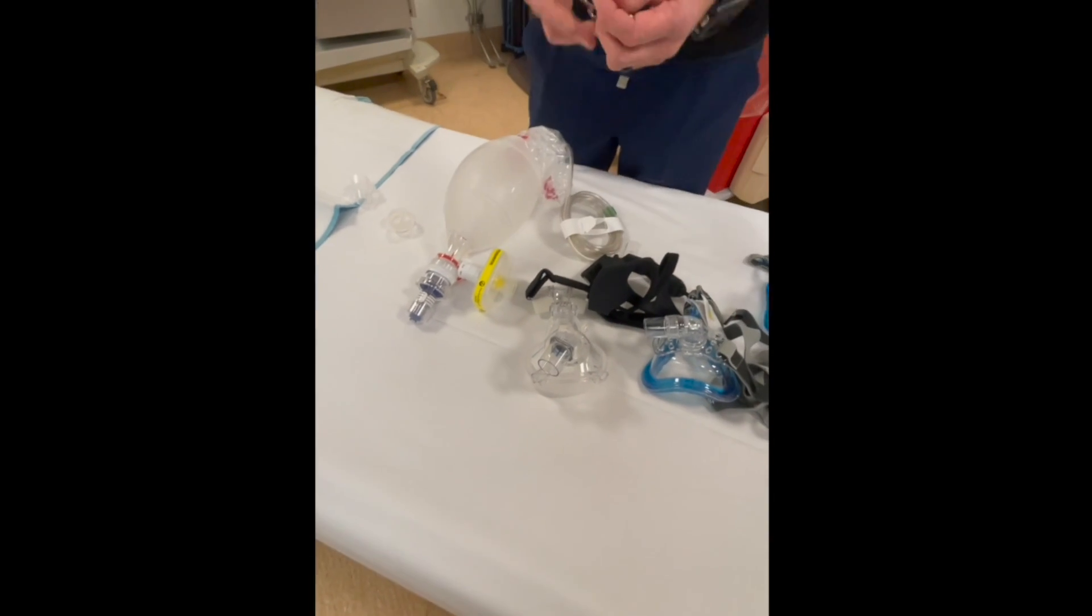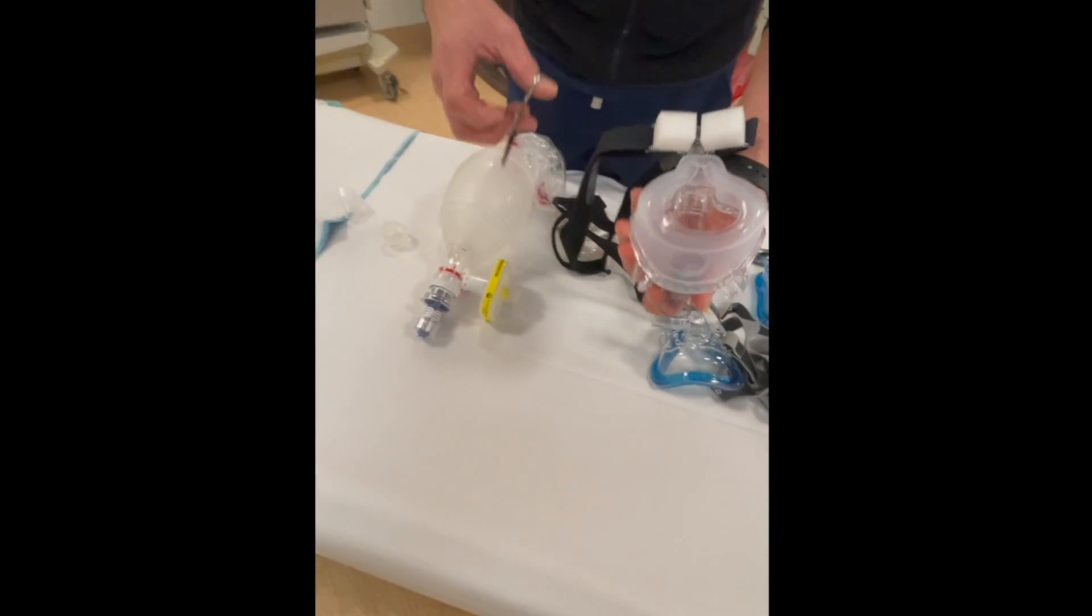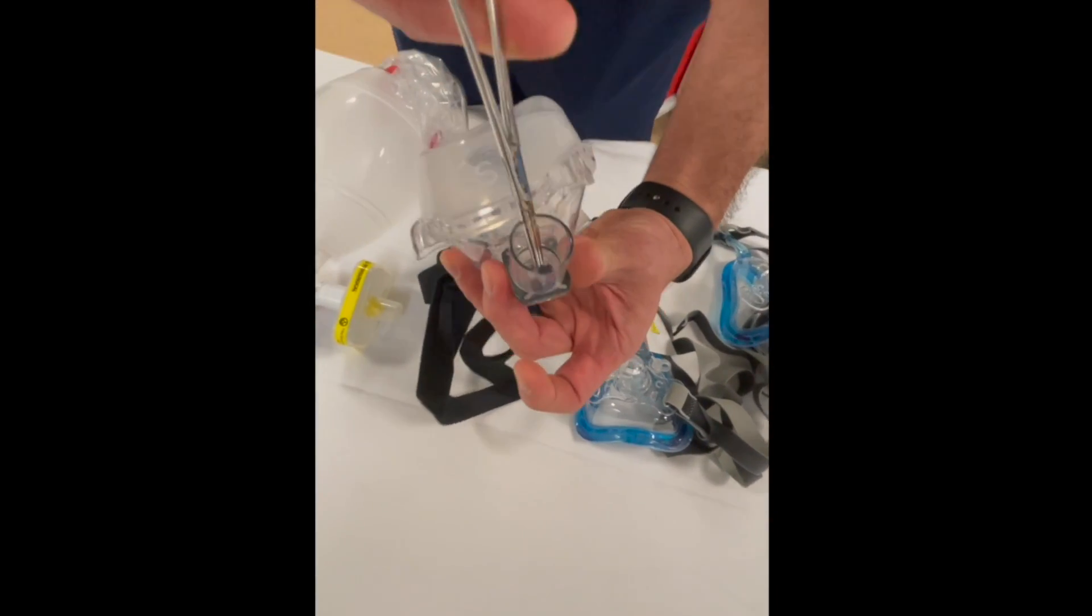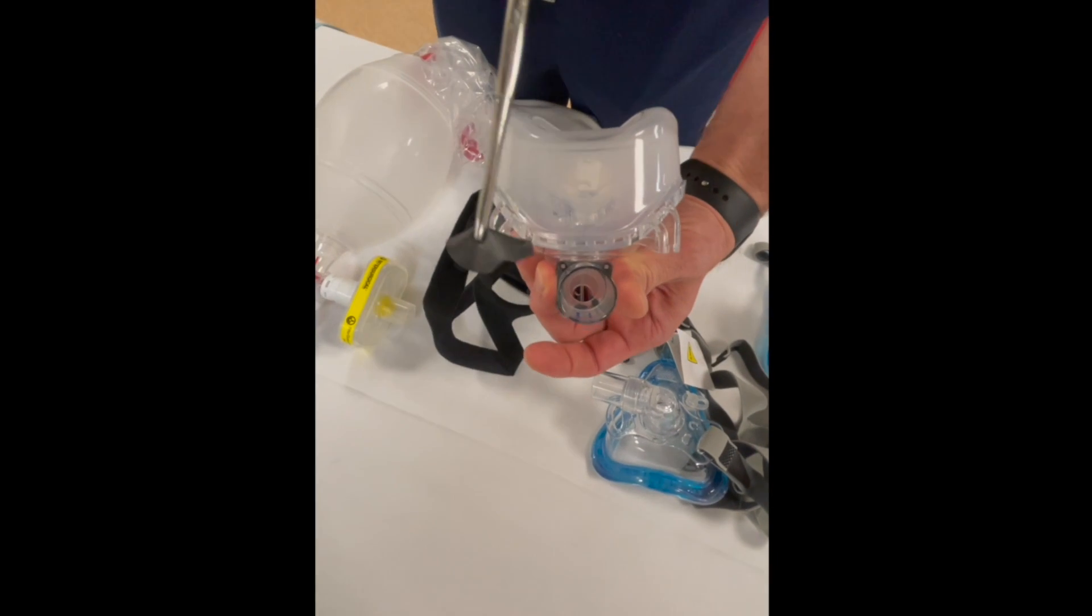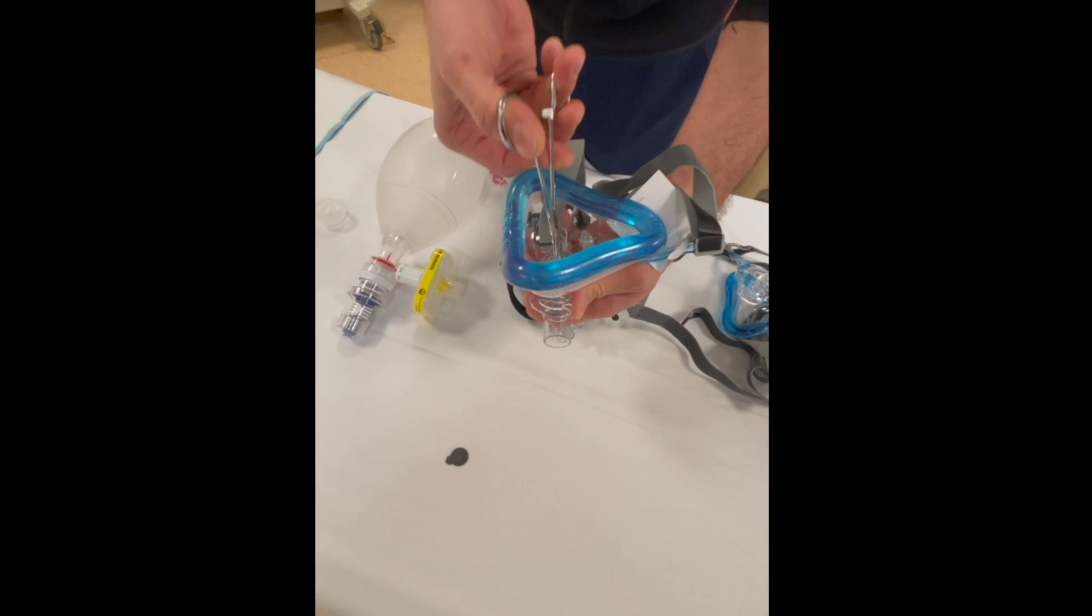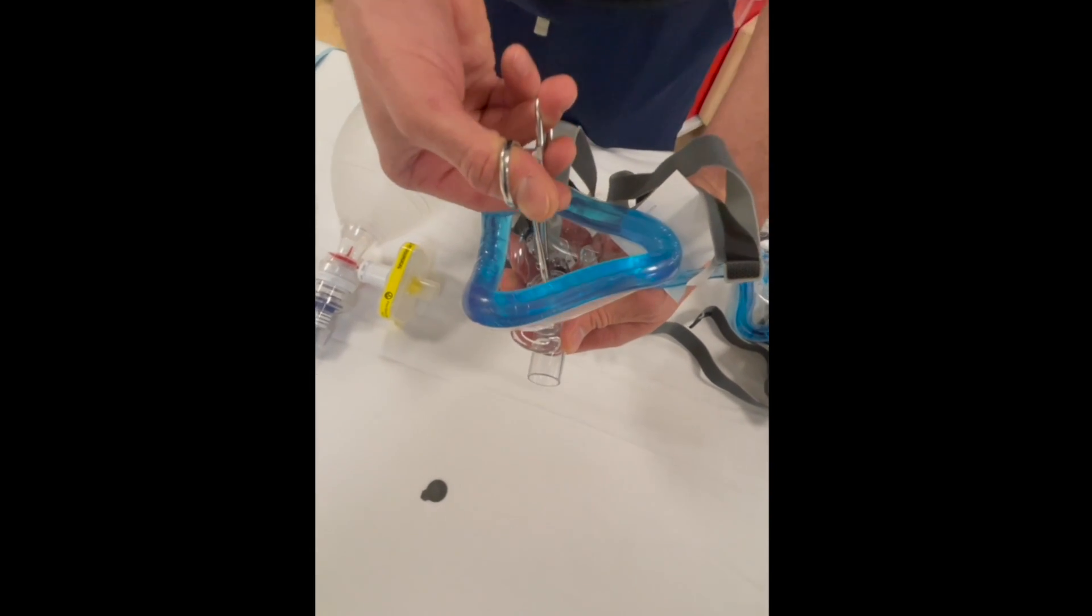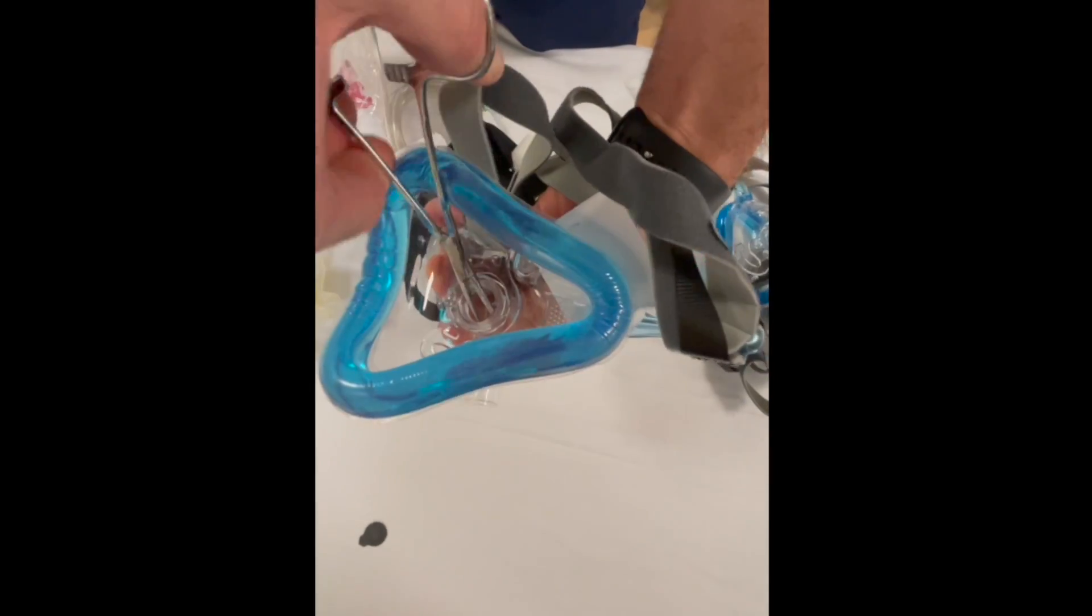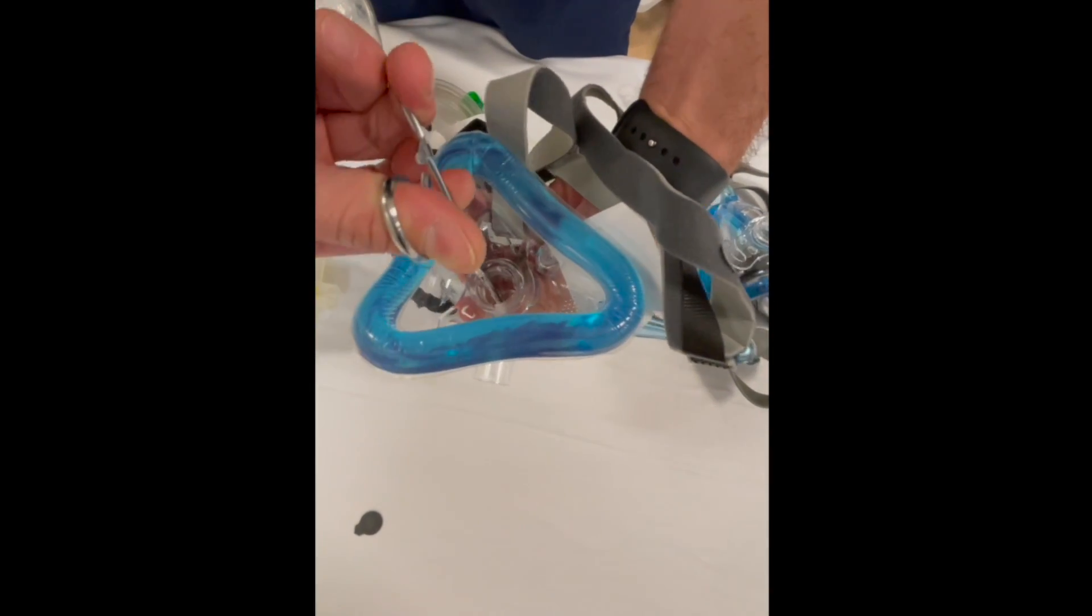How I do it: I usually grab a pair of Kelly clamps or whatever you want to use, and then you just go in and literally just grab it and pull it out. On this one it's going to be the same thing. You can either reach in through the mask here if you can't grab it, and you're going to remove the actual valve.